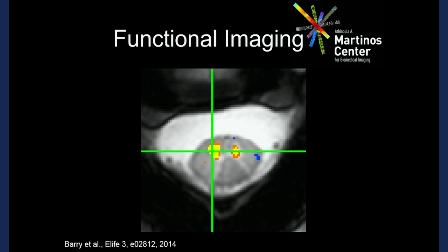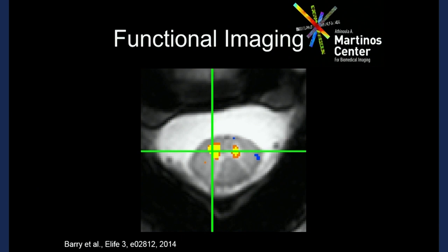We've also been taking a look at functional imaging. This kind of means, with regards to the previous terminology, how can wire 2 in the left part talk to wire 2 in the right part? There are projections between the two. So you can investigate biomarkers for how, when demyelination happens and there's breakdown in the white matter, it can start to disrupt the connections within the spinal cord. So this is extremely new stuff.